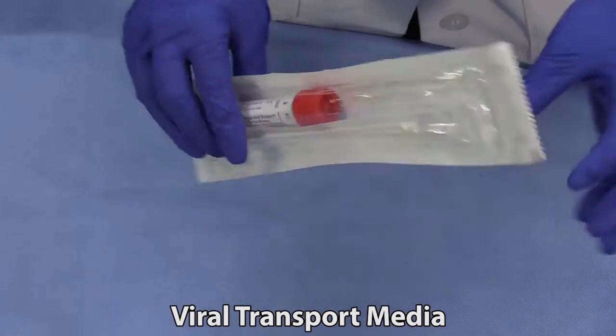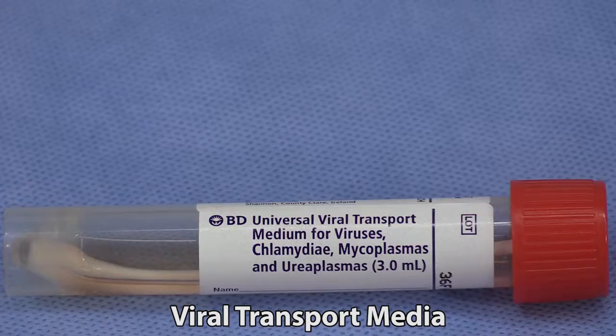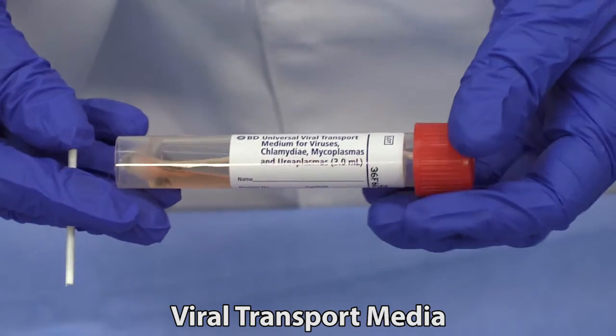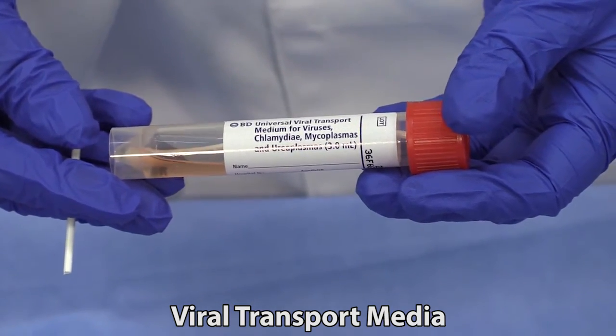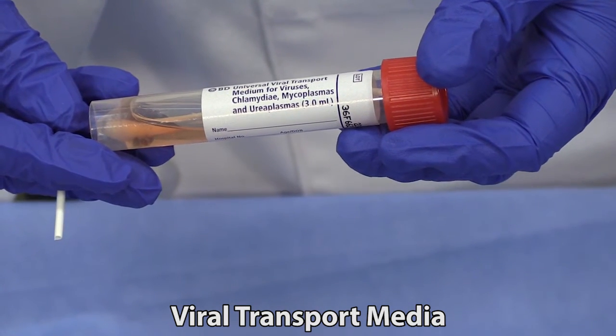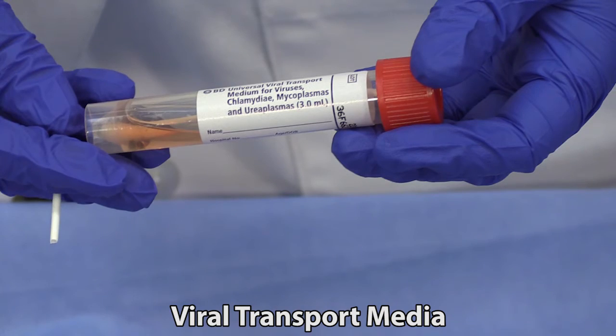Viral transport media is a liquid media that is designed to enhance the survivability of viruses. It also provides specialized conditions needed for certain bacteria. This media contains antibiotics that inhibit the growth of some bacteria that would otherwise overgrow the plate, making collection of slow-growing bacteria impossible. However, these antibiotics also make it unsuitable for routine bacterial culture. Viral transport media is an excellent choice for swabs submitted for PCR testing, both for bacterial and for viral pathogens.